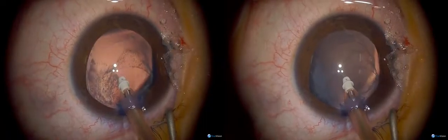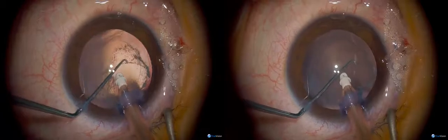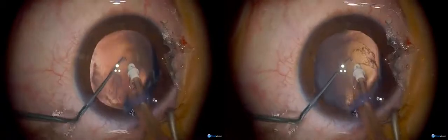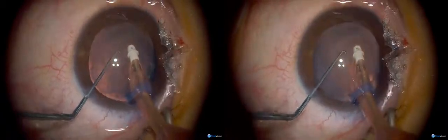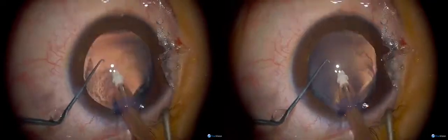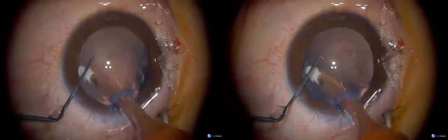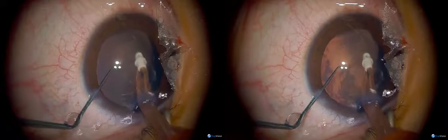It looks to me like he's got some sort of breach in the posterior capsule here. There's a little — it looks like another membrane there. So maybe that's why he's got a cataract — he may have had a breach in the capsule from trauma or something. It's difficult to know what to do with that because I'm not sure if it's part of the posterior capsule or what.